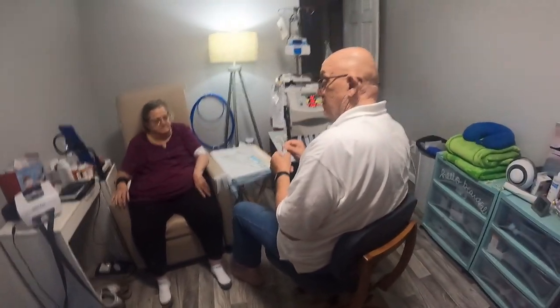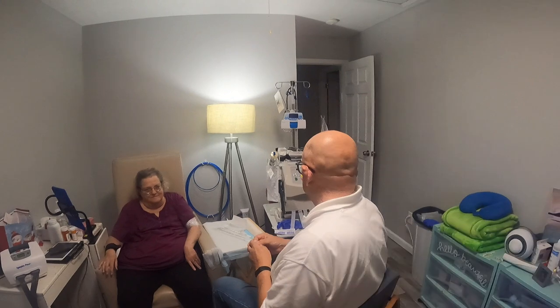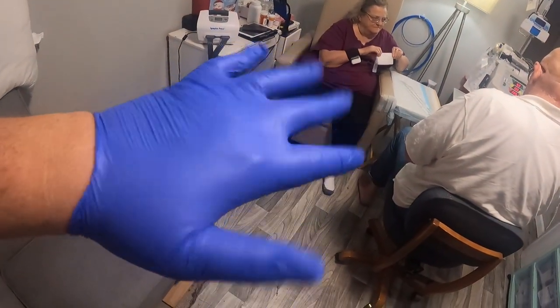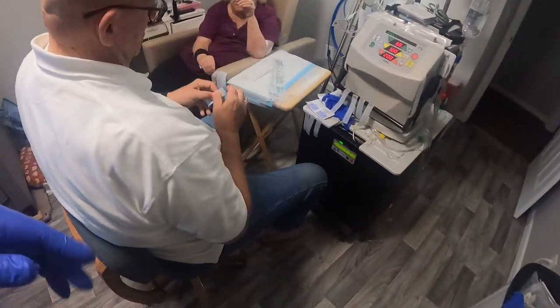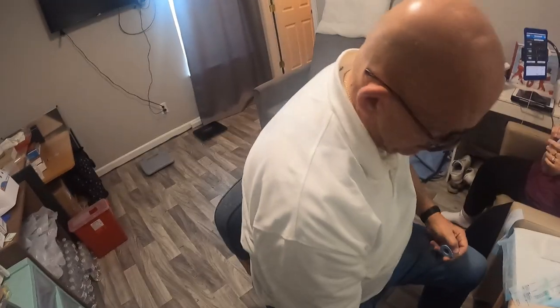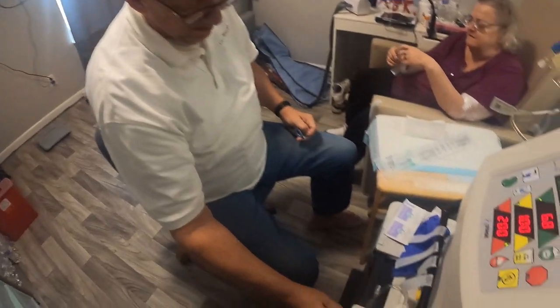Today I'm going to wear gloves, somewhat like you guys. Oh, these are thick. Those are nice gloves. They're called nitrile. You knew that, right? Yes, sir. But my viewers might not know. These are nitrile gloves. Wow, they feel really cool. We've got some latex somewhere, but we don't like the latex ones. I'm allergic to latex, or my body's just being a wuss. We always make sure that Mary is non-latex.